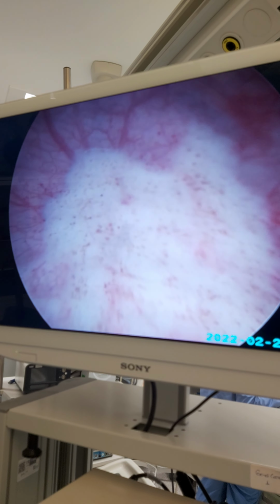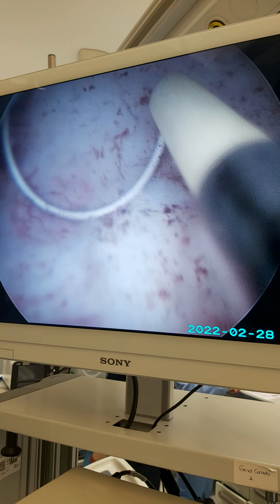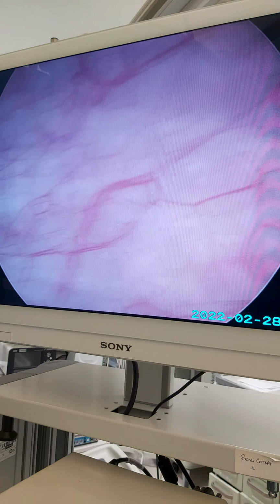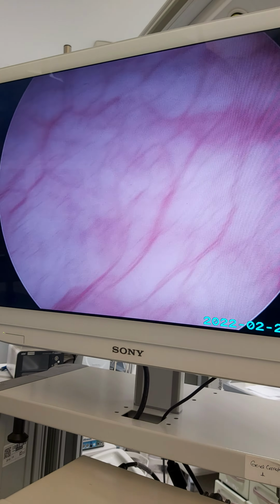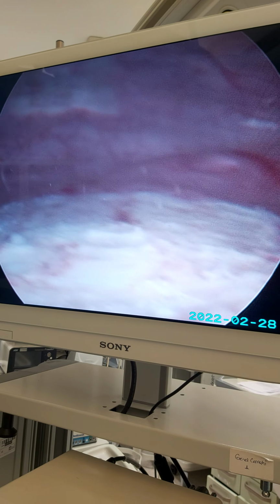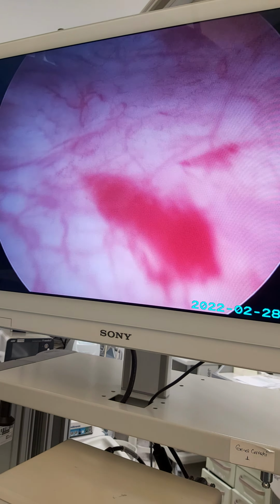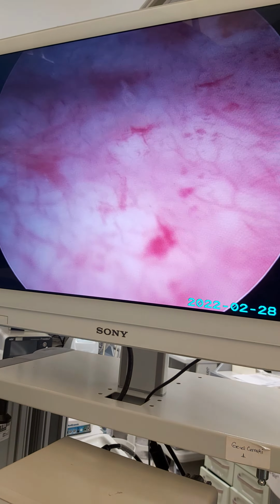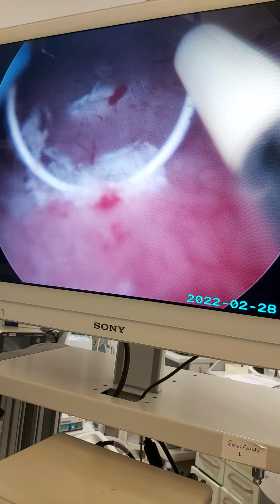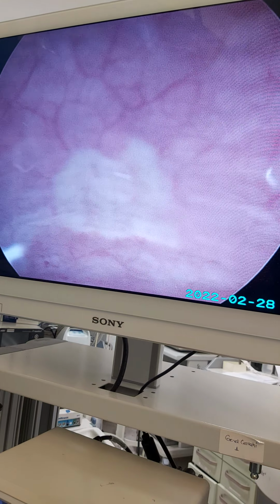Okay, it's okay. We fulgurate this part also, very superficially. I just want the new mucosa to come over these tissues. Okay, these are the healthy mucosa. It seems enough now. Orifices. Yes, these do not belong here. I don't want any bleeding spots. Urine has come. Okay, we finished.